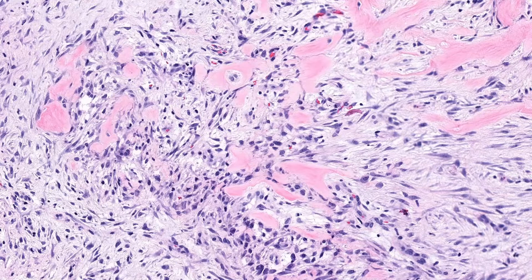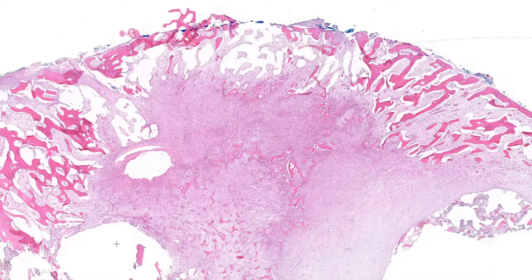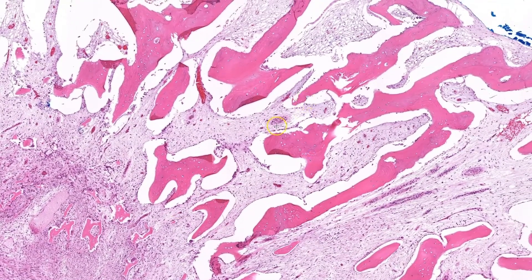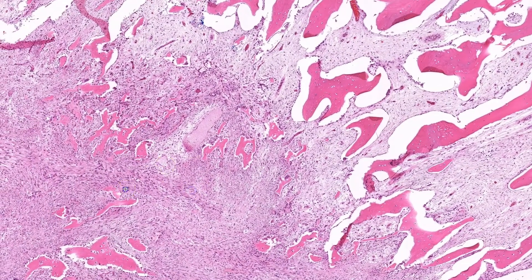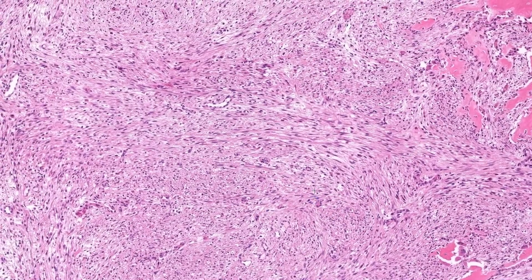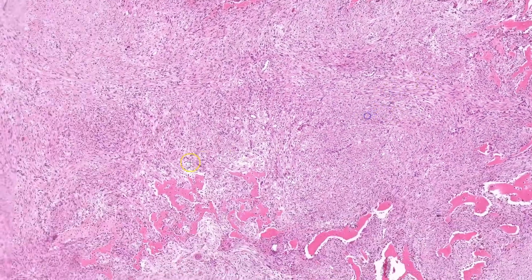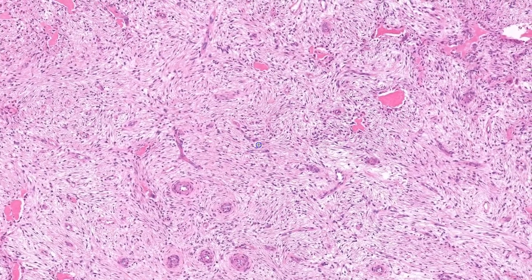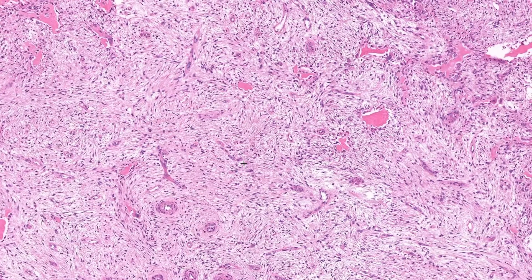This one is tricky, especially on biopsy, but to give you a better sense of this entity, I'm going to show an excision specimen. The key feature here is zonation. At the periphery, we have the well-formed trabeculae of mature lamellar bone, and then moving in towards the center, this transitions into woven bone, with the center of the lesion being composed of this myofibroblastic proliferation. Some areas can be more cellular; however, other areas have that loose tissue culture-like appearance, which can be seen in other USP6-rearranged tumors.